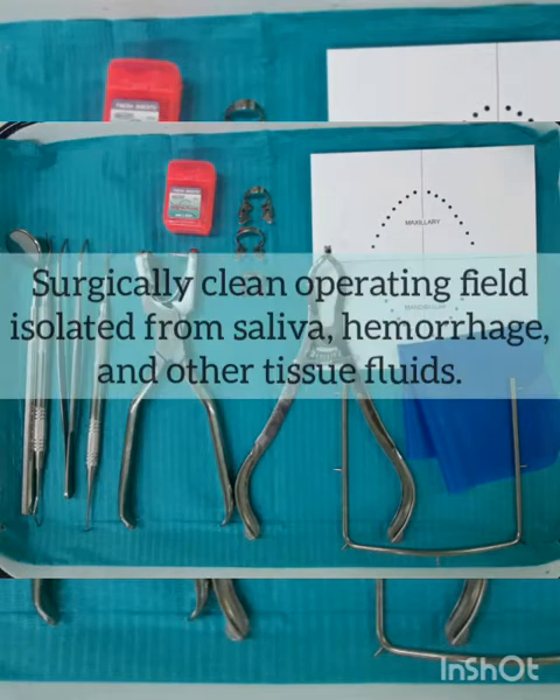A surgically clean operating field is isolated from the saliva, hemorrhage, and other tissue fluids. The dam reduces the risk of cross-contamination of the root canal system and provides an excellent barrier to the potential spread of infectious agents. It is a required component of any infection control program.